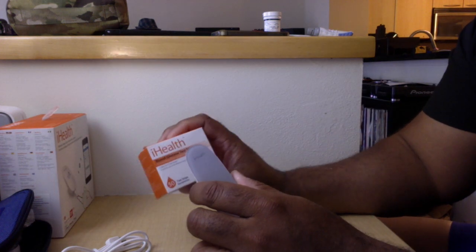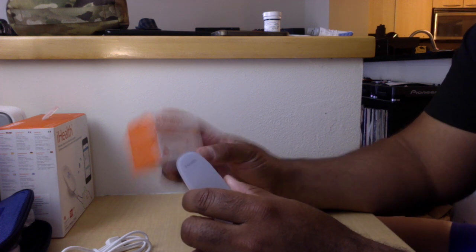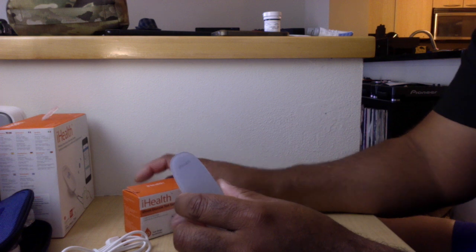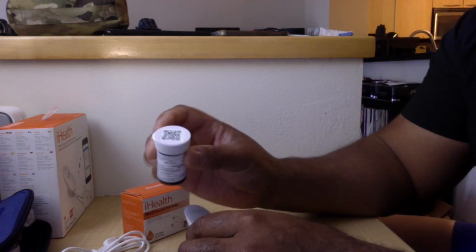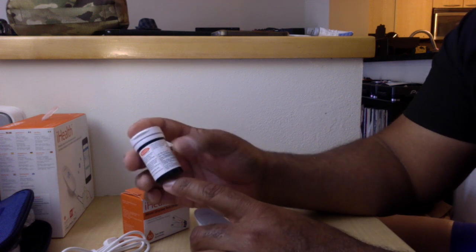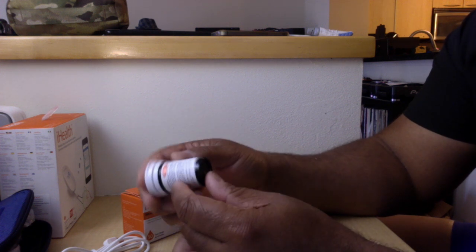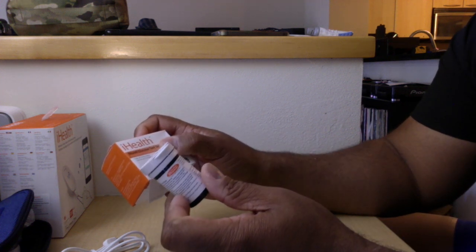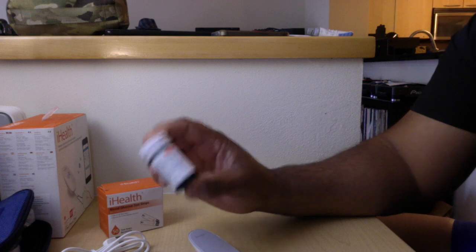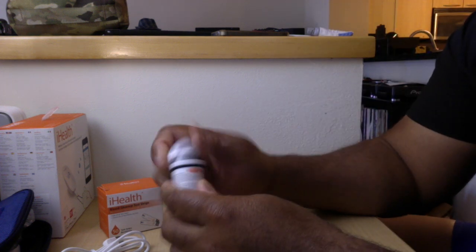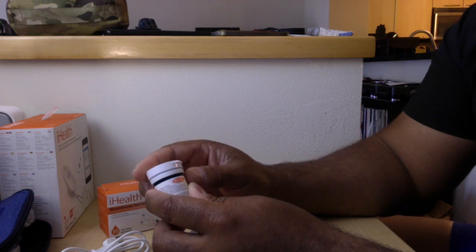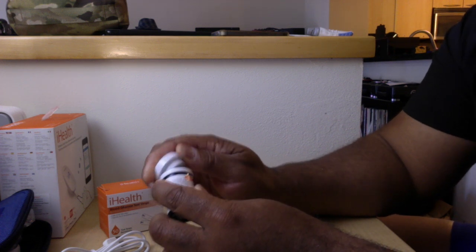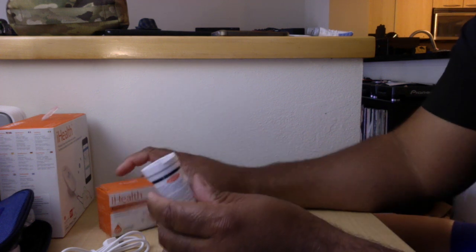One of the questions I saw people asking: when you start this you need to scan the top, and then these will be good for 90 days and there's 25 in here, 25 per tube. So you'll need to keep in mind that when these go bad you can throw them away. I don't know how often I'll be testing my blood sugar, but probably for the first 30 days I'll test it enough where I'll go through this entire box.